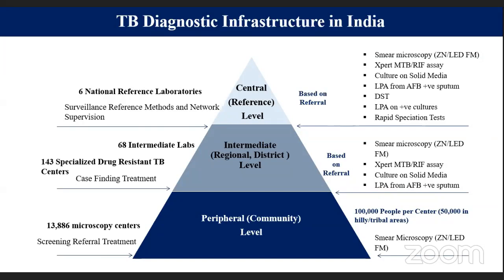So these labs not only go for a TB test, but also for resistance tests of TB, where extreme resistance or multi-drug resistant TB is also tested. Similarly, after diagnosis therapy is recommended, and all the fast and advanced equipment is available in these labs.